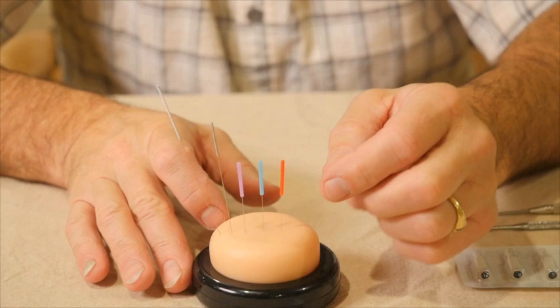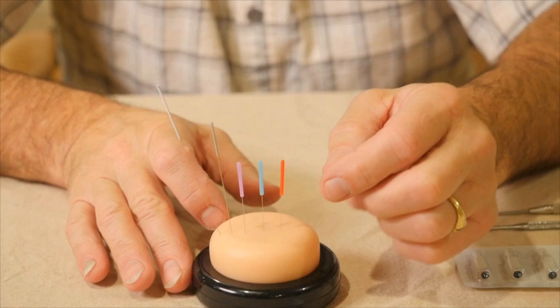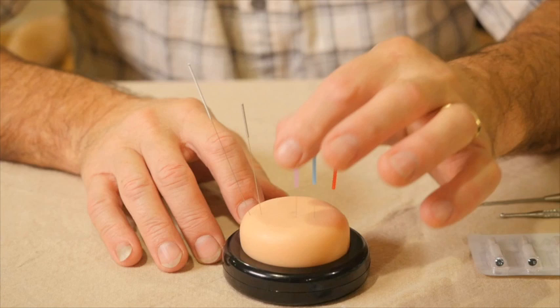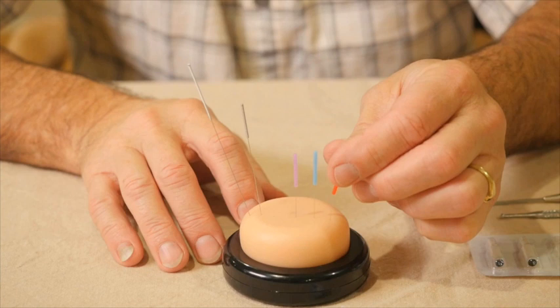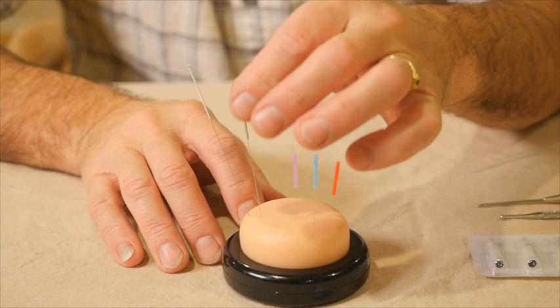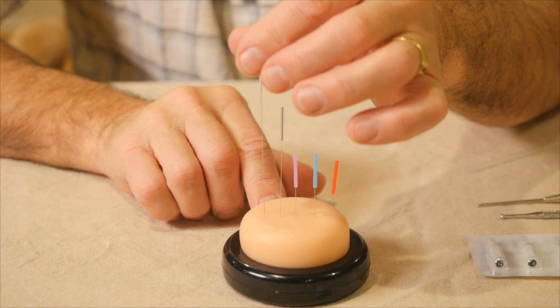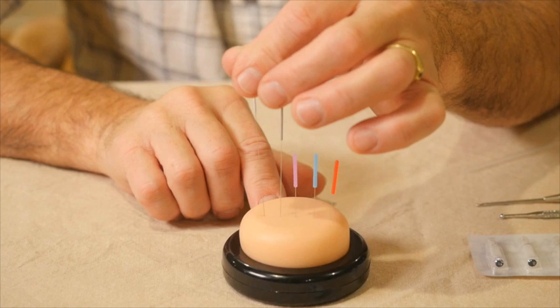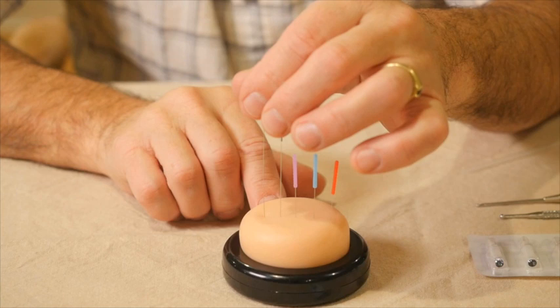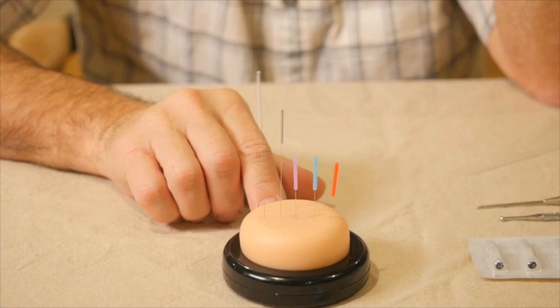I want to point out how the needles bend during freehand insertion. The 1-inch needles go in very easily with very little bending, though the number 1 will bend the most easily. As we get into longer needles, you start to see a little bit of movement during insertion, and with a 2½-inch needle that movement is quite visible. The longer the needle is, the thicker you generally want it to be in order for it to be comfortable for your patient.